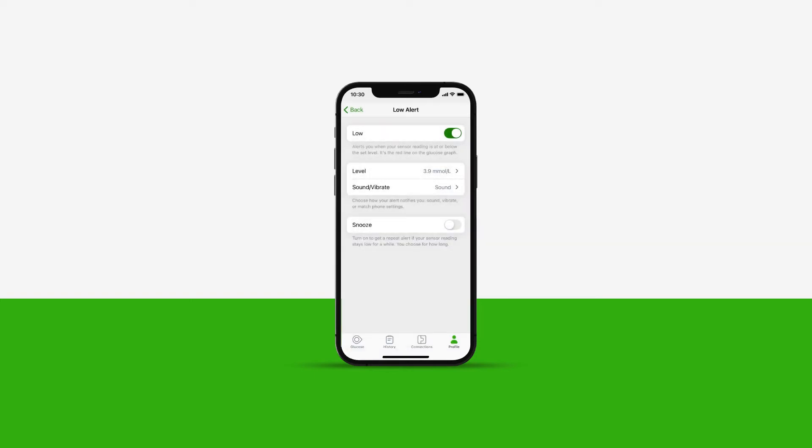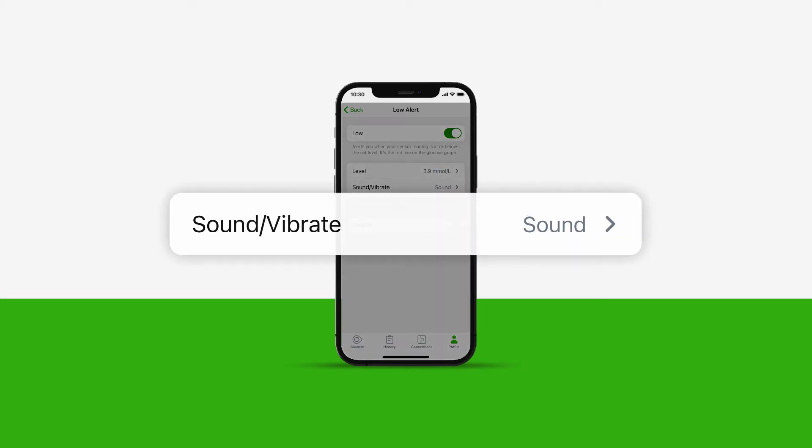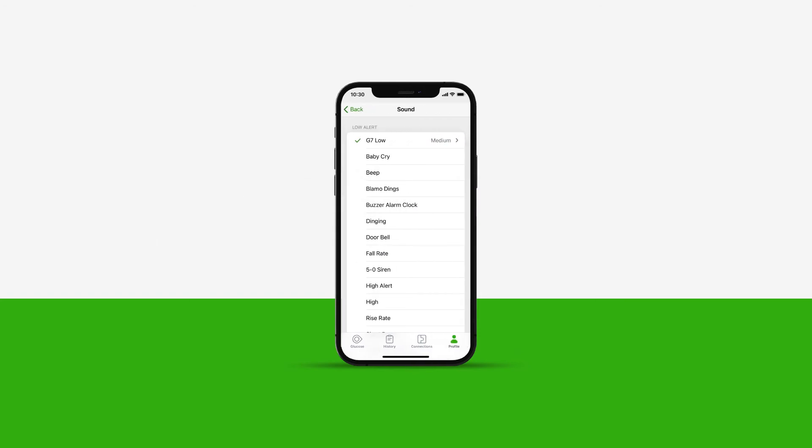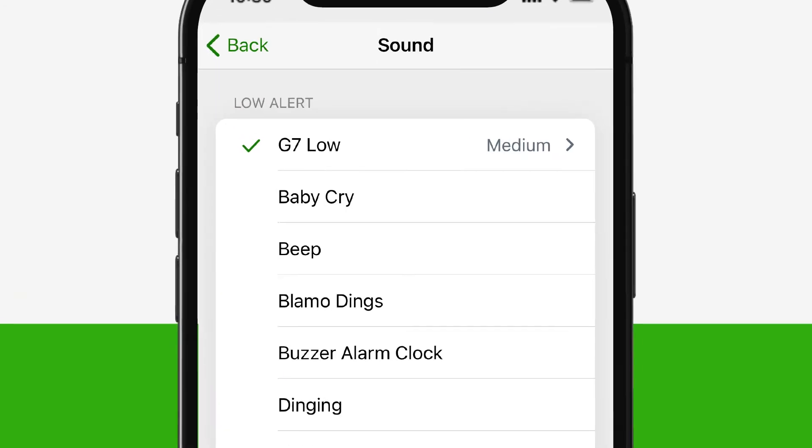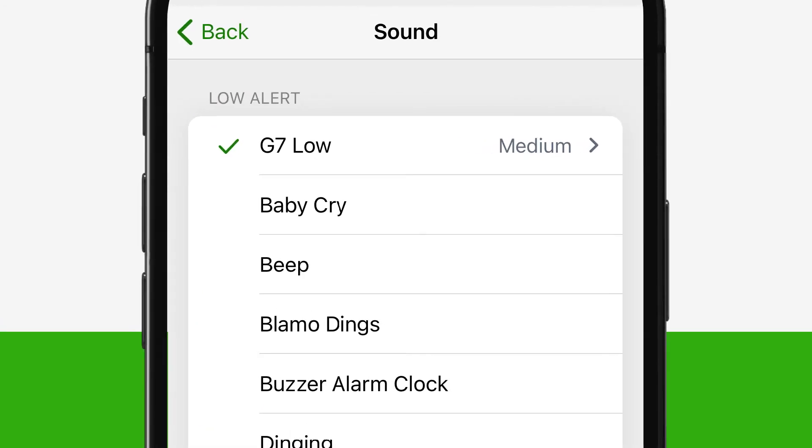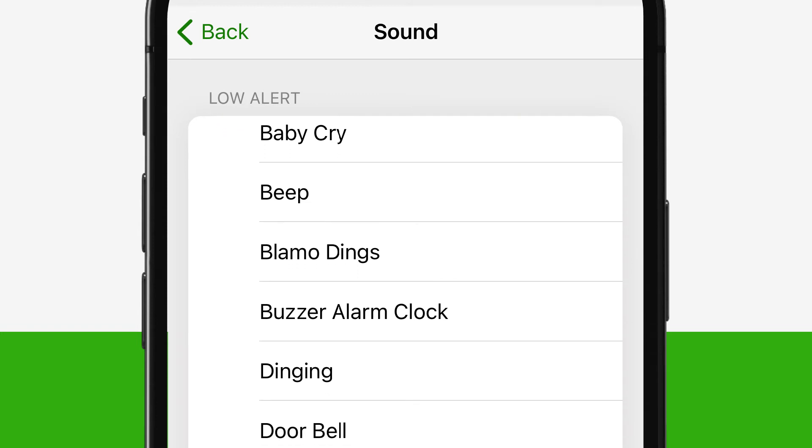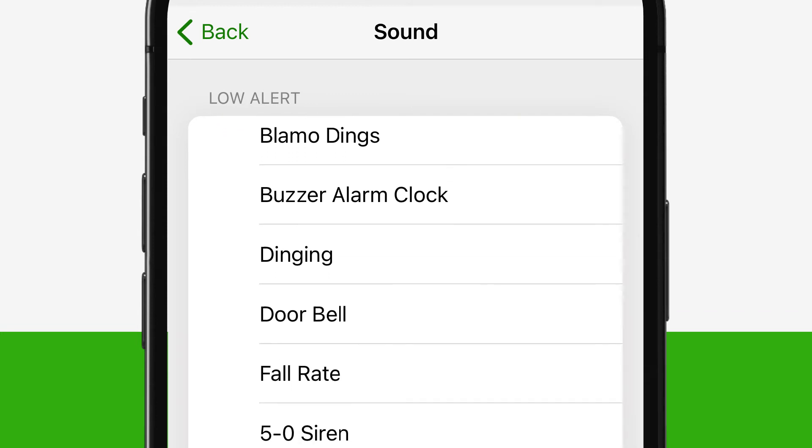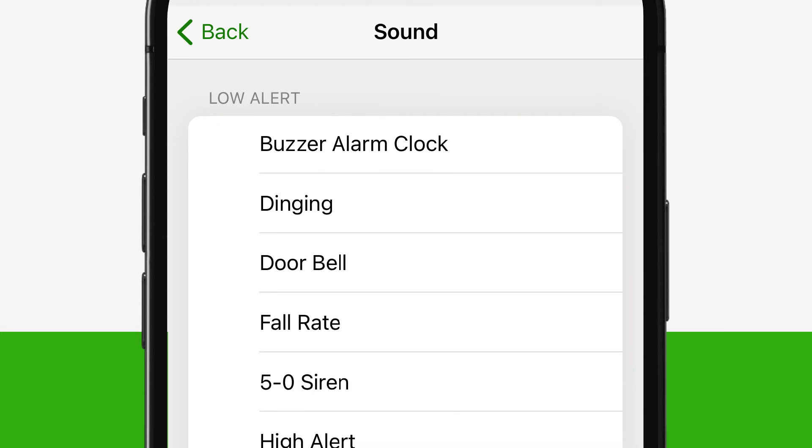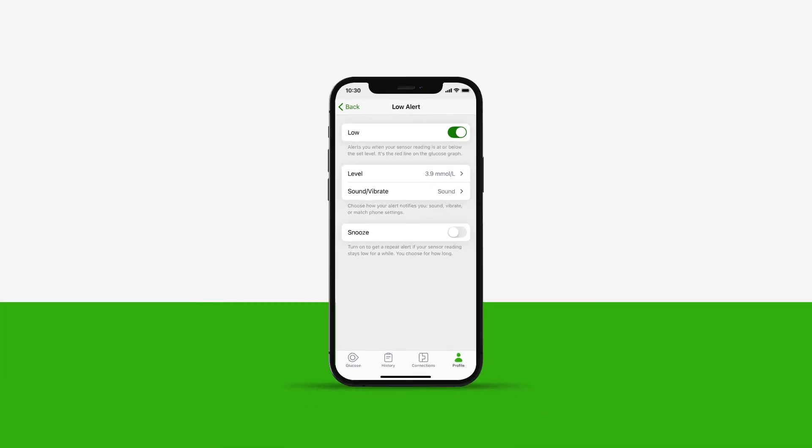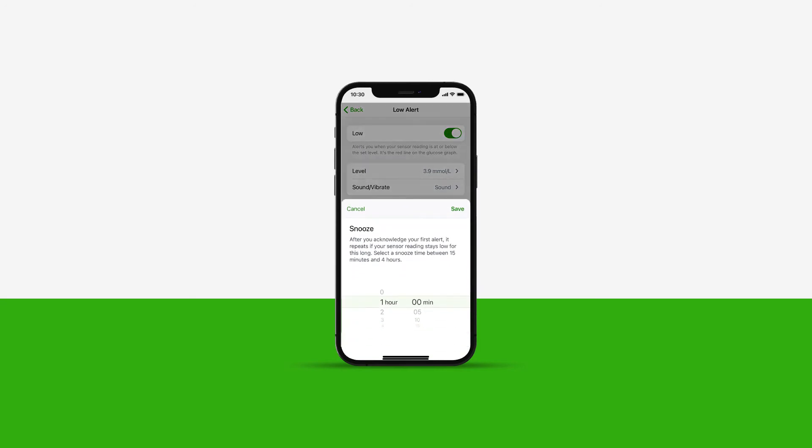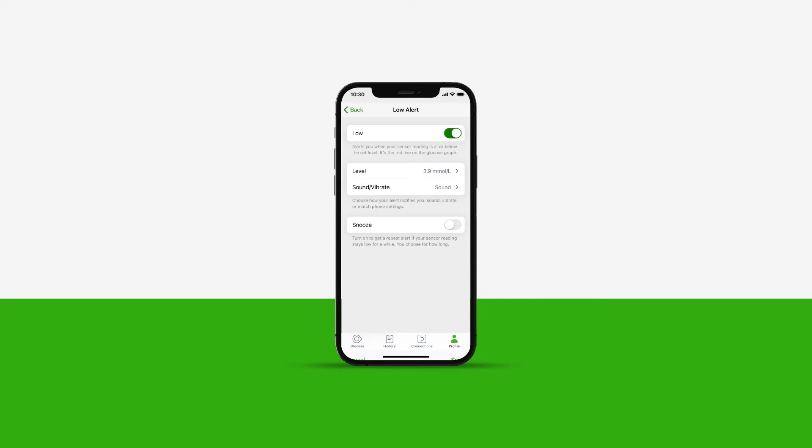You are also able to customize how your alert notifies you: sound, vibrate, or match phone settings. Under Alert sound, you can also choose your sound option from an array of sounds. You also have the option to turn on Snooze Your Alert. Turn this on to get a repeat alert if your sensor reading stays low. You can choose how long your snooze time will be.